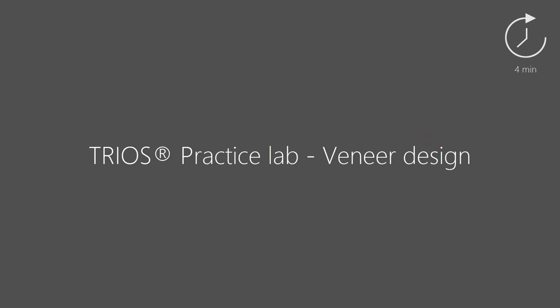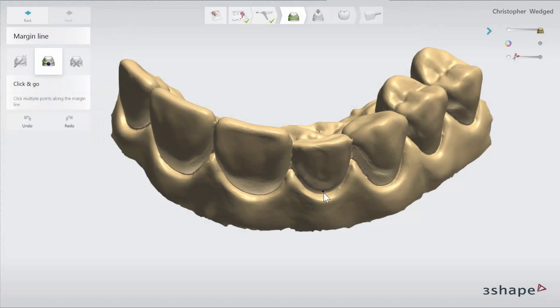In this video you will learn how to design a veneer using the Practice Lab anatomy design module. Once in the design module you will start with setting the margin line. Auto setting of the margin line is not available for a veneer.